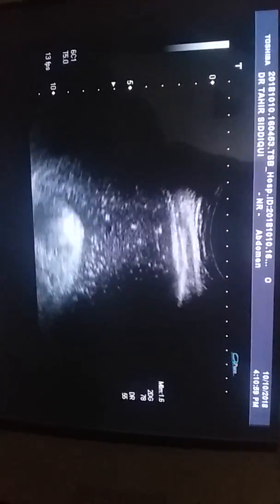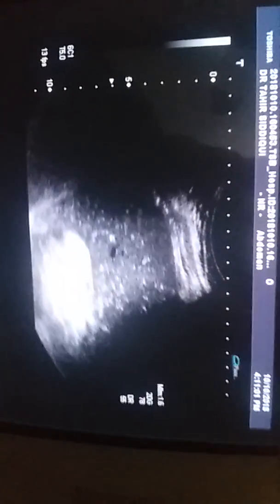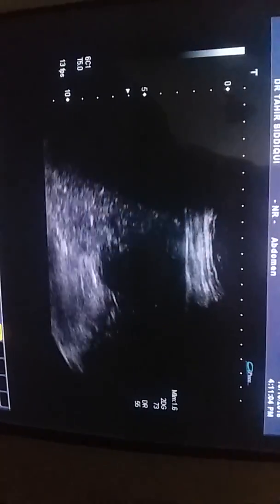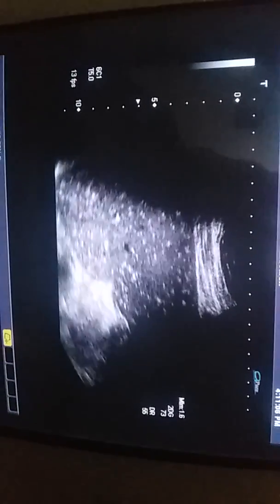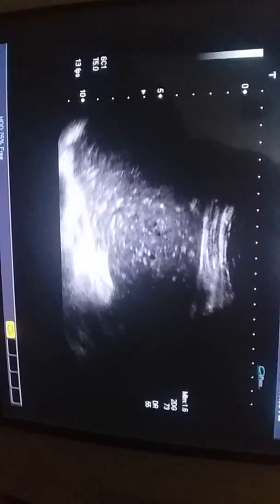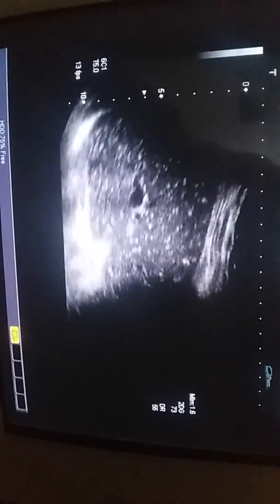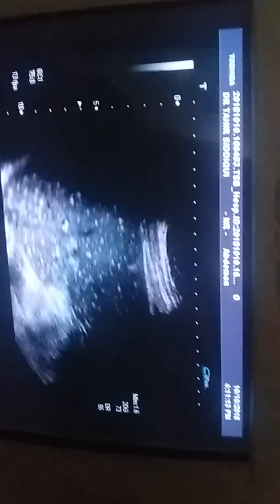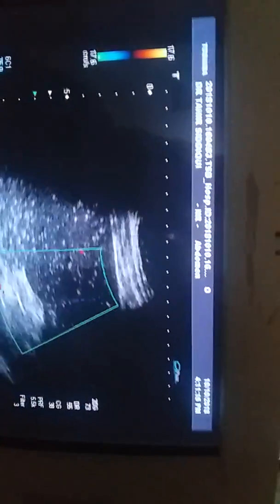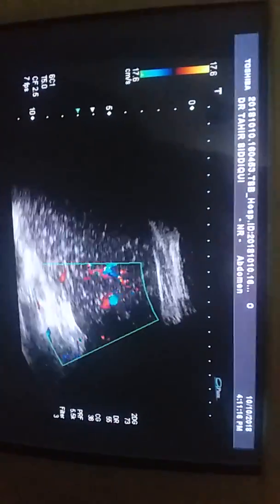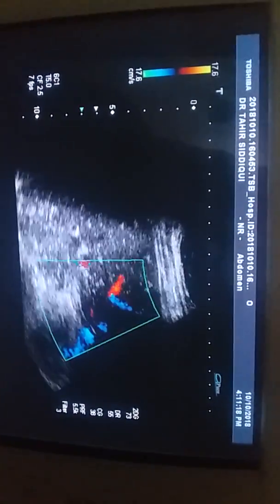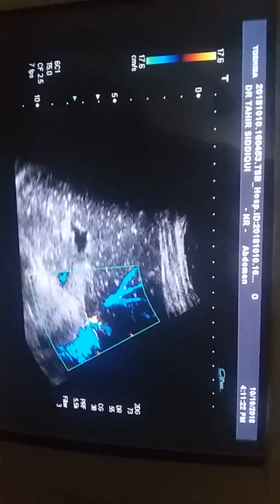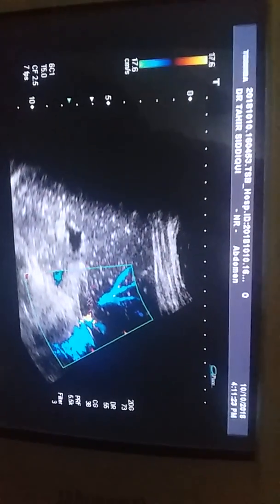Now this is the spleen. The splenic parenchyma gives us the same appearance as we saw in the liver. This is the spleen, and this is the splenic vein.